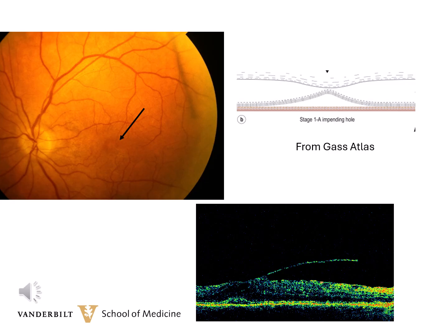As I mentioned in one other of my chats, you can get a yellow reflex from central serous, from a drusen, or even an early macular hole. The OCT is the way to distinguish all of those. And again, here's the diagram from Gass's Atlas and an old OCT showing the vitreomacular traction and the dehiscence of the photoreceptors.